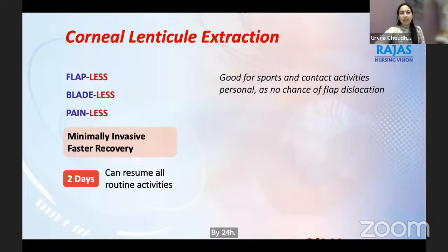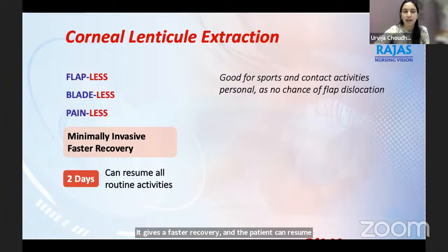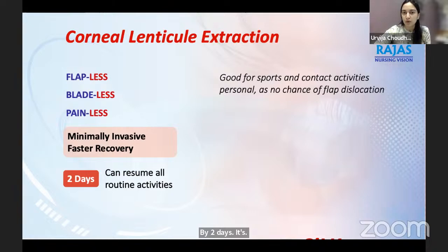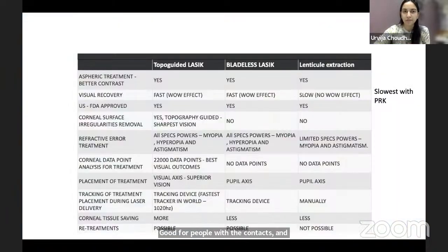So the corneal lenticule extraction procedures are flapless and painless and bladeless. So it's minimally invasive. It gives a faster recovery and the patient can resume mostly all the activities by 2 days. It's good for people with contact sports because there are no chances of flap dislocation here.